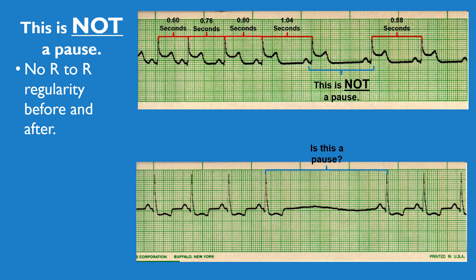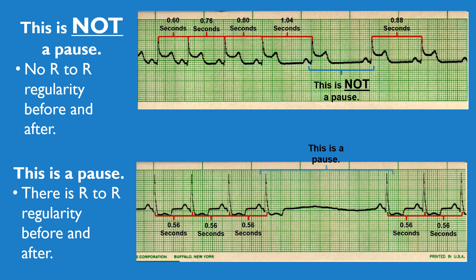Looking at this second example, we do have a larger gap so it appears there may be a pause. We measure the R to R intervals before and after this gap, and we do have consistent intervalling between the R to R intervals both before and after. Since they are consistently intervalled, this is a pause and not just a gap. To reiterate — what we need to look for to have an actual pause is consistent R to R intervalling before and after the gap.